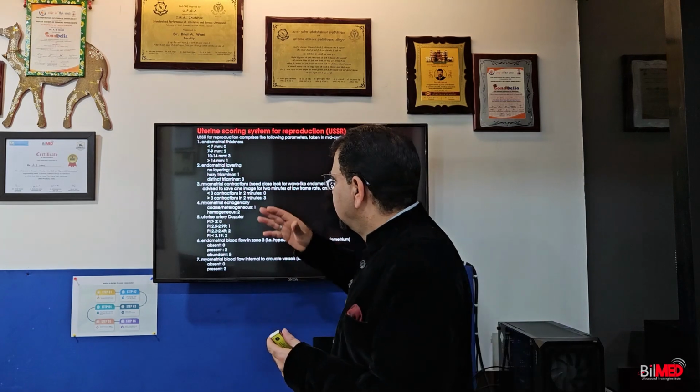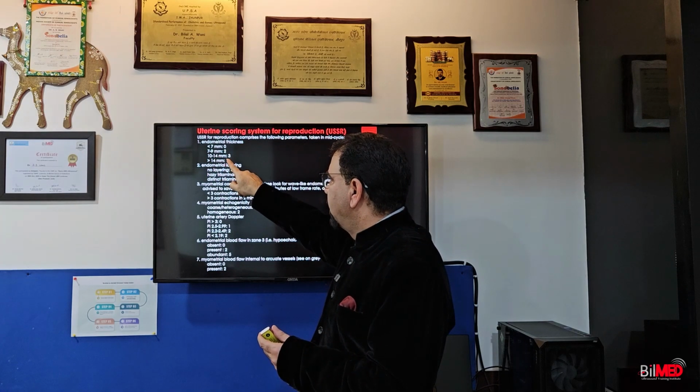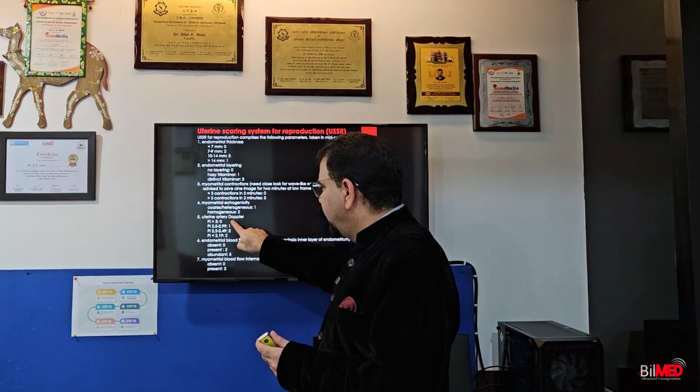Now see, I don't want you to take a calculator and calculate all these points, but the main important point is that you at least make a clear understanding that increase in the endometrial thickness is decreasing the score. Point number 1, take home message. Point number 2, uterine artery Doppler PI, dropping PI is good for an infertile patient.